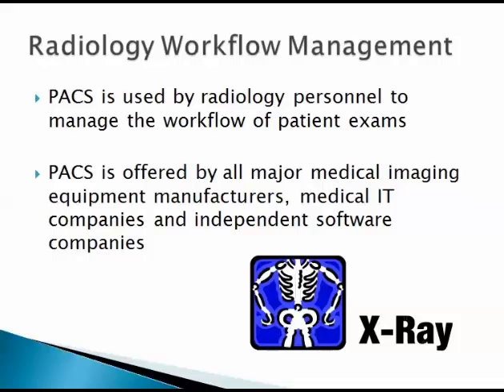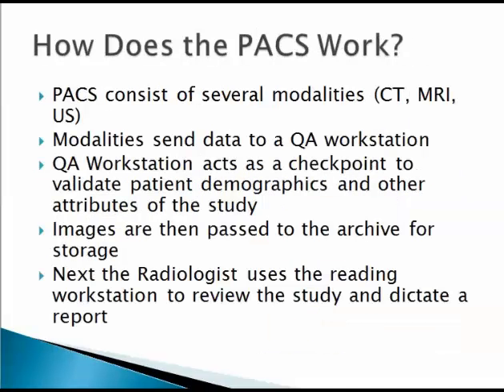It's used pretty often now, and it has great functionality. So how does the PACS actually work? You may wonder this. Let's start from the beginning.